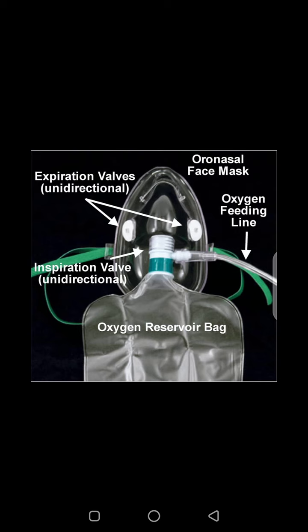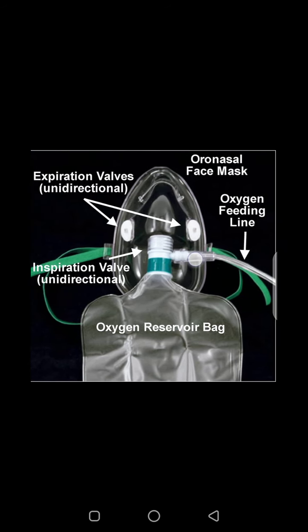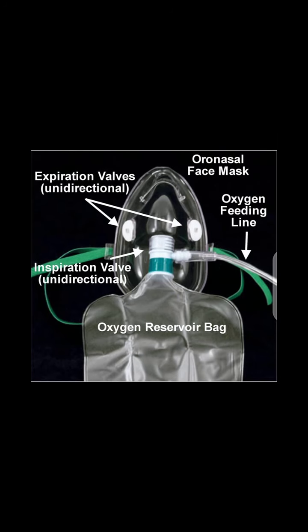So you can see the oxygen feeding line. The oxygen enters through here and goes into the reservoir bag. When administering oxygen via non-rebreathing face mask, we must ensure that this reservoir bag is filled up with oxygen.